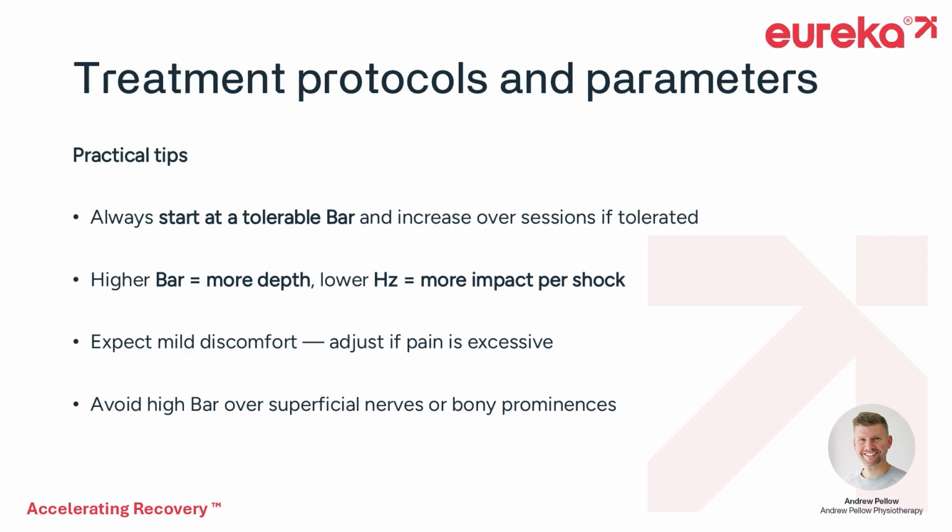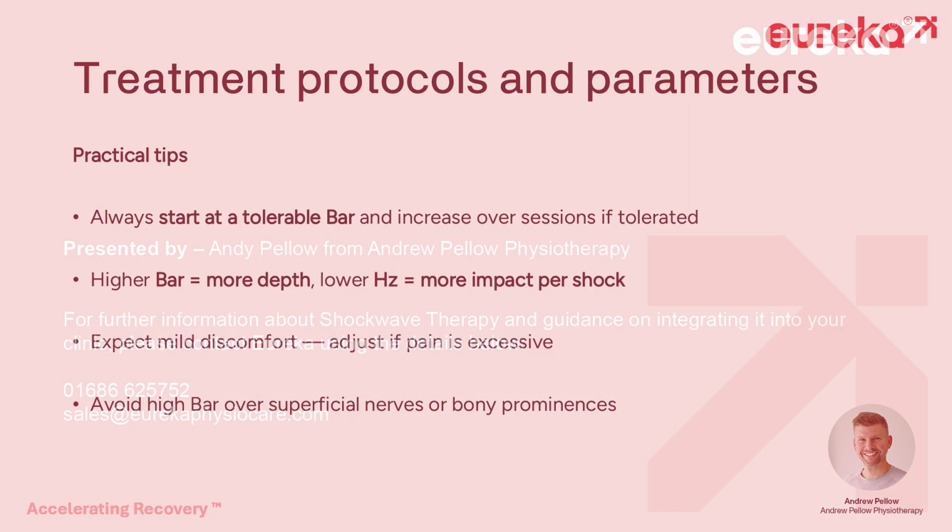The information presented within these slides should act as a useful resource for treatment parameters, but the International Society for Medical Shockwave Treatment also have a clinical guideline which also includes condition-specific treatment parameters.